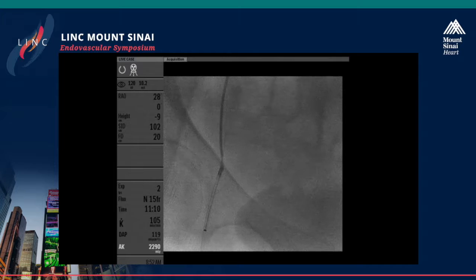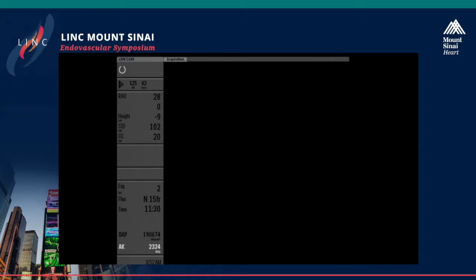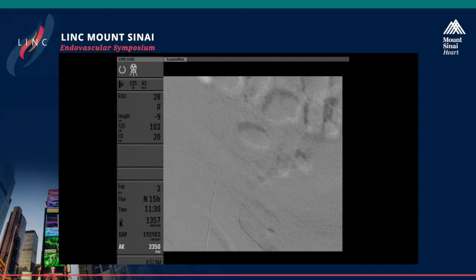Yeah. I wouldn't recommend using the Supera stent, because just in case you would need to get access through the groin here for coronary procedures or whatever reason, it's easy to insert a sheath through a traditional nitinol stent, whereas if you have a nicely expanded Supera stent, it's not so easy to get a sheath across the struts. This is not my experience, Thomas.